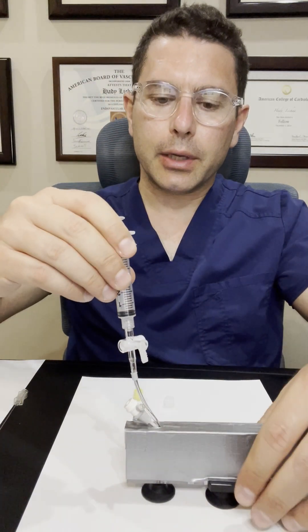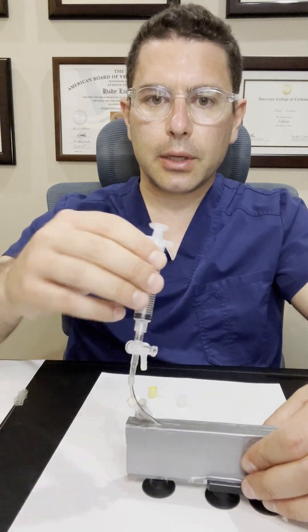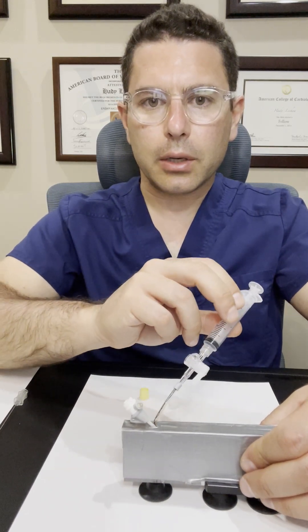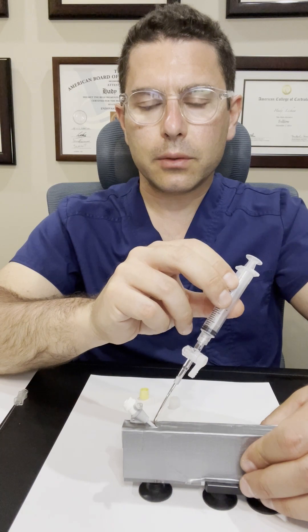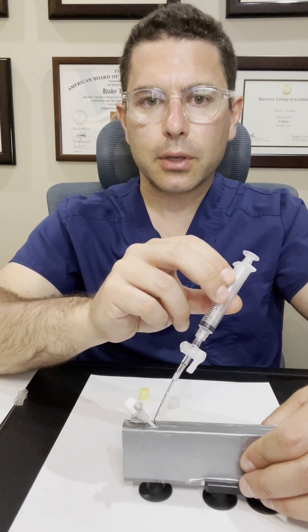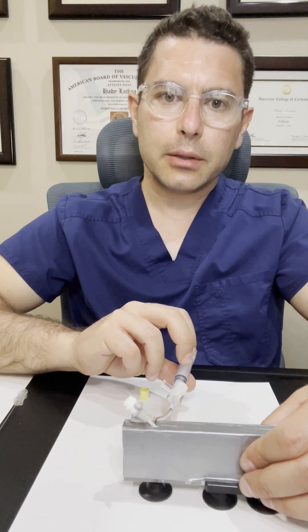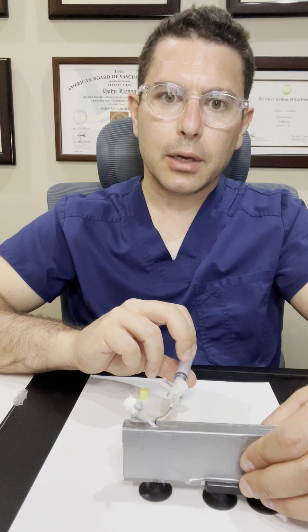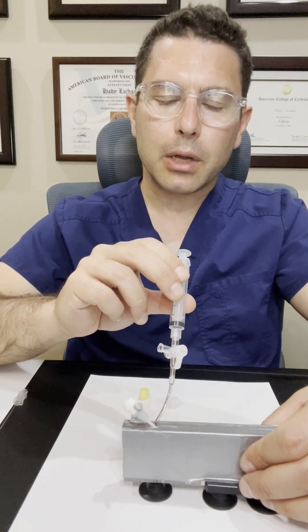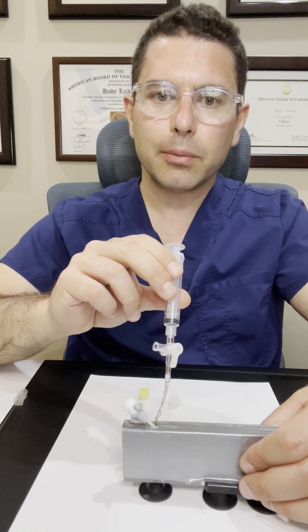And we're going to place the plunger in. And now you have a closed system where you have the sheath, and those perclose sutures are laying inside the tubing of the side port of the sheath, and the syringe is covering the outside portion. This can be laid to the side and covered with an adhesive dressing. It plays the role of both pulling the non-locking suture up and cinching the arteriotomy site to minimize sheath oozing.